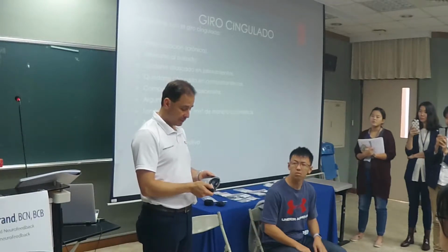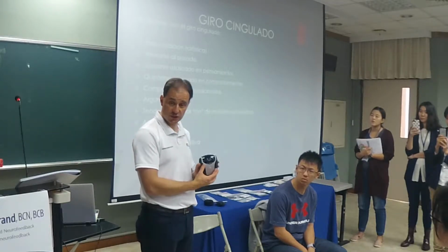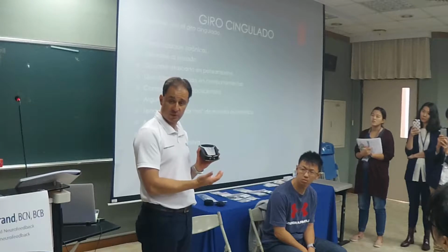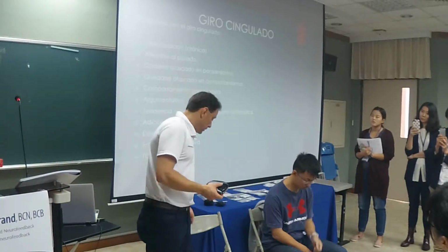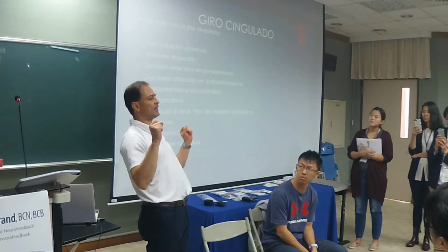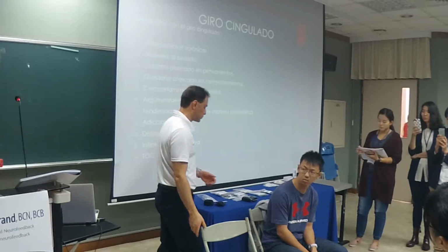Okay. This new version of the amplifier is very neat because it's got a built-in battery that can be charged, so you can charge it, and it records time. And the SD card has a larger memory if you want to record. So it's a very beautiful equipment. I really like it. I'm going to place it behind the client, and normally in your practices you will have a reclining chair which is very comfortable. You will have a small table behind it where you can place equipment. But for practical purposes we're going to do it this way.